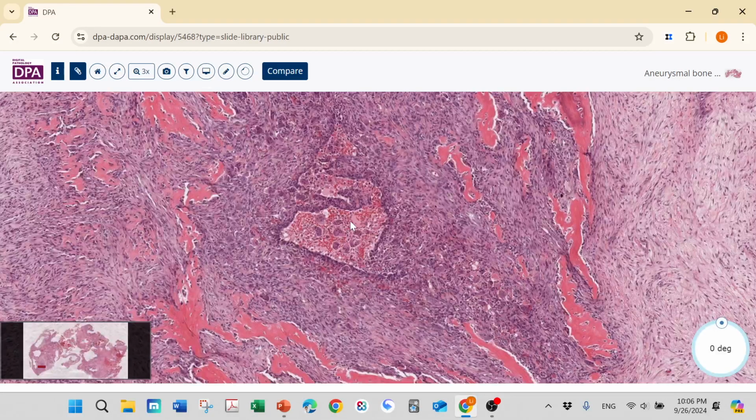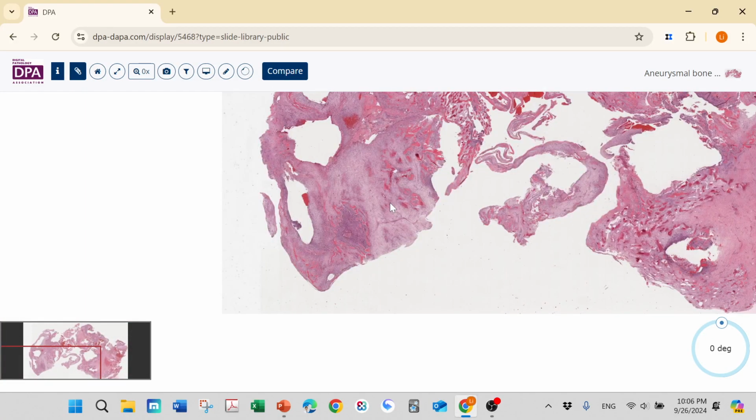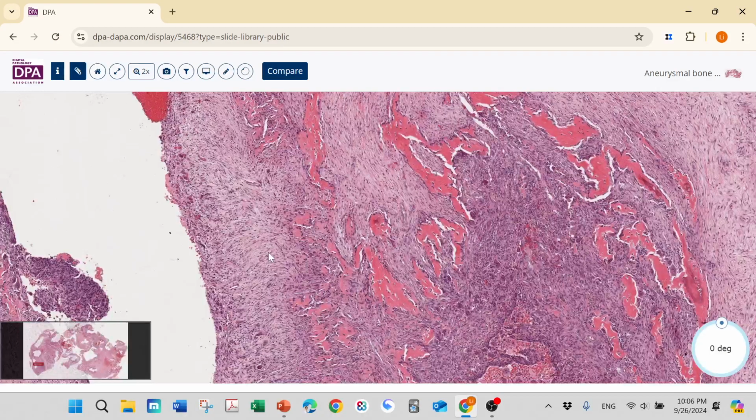However, when we look at the low power image, we know that not all the area is like this. We already have this multilobulated, loculated, and pseudocyst. So this is not giant cell tumor of the bone. Then you still remember I talked about USP6 in this entity, because another translocation with USP6 in the soft tissue world is nodular fasciitis, that is MYH9-USP6. So both ABC and nodular fasciitis have USP6. So we will find some areas mimicking each other.